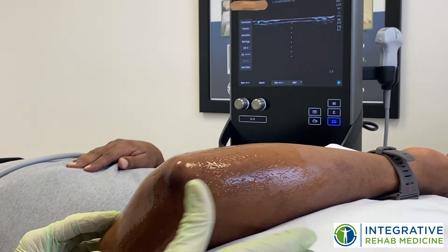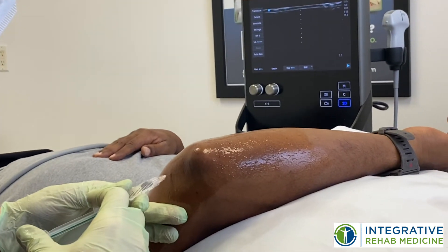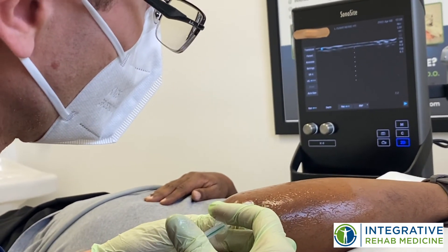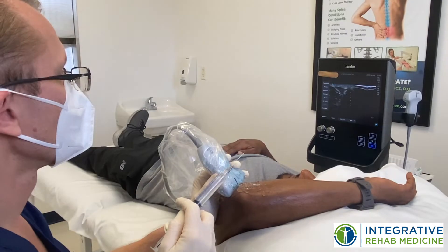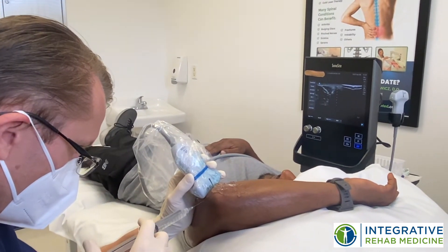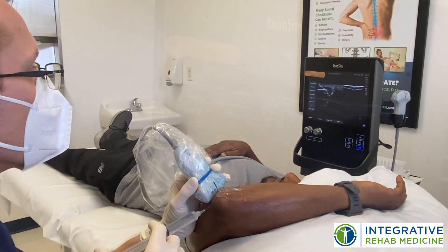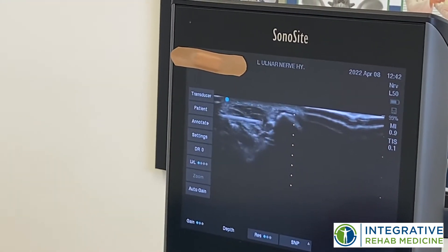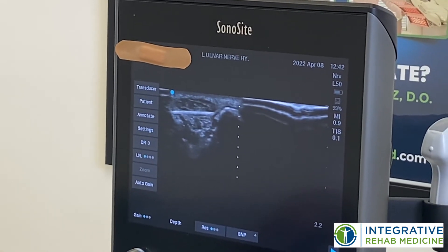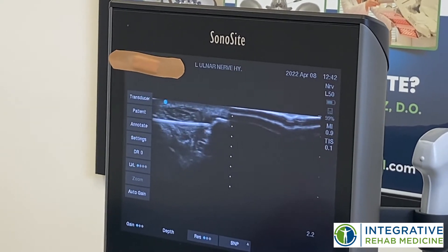I'm going to numb up the entry points. I'm going to start by decompressing the nerve a little bit above. You can see my needle going towards the nerve, and I am right close to the nerve. We're going to inject a little bit of the solution above the nerve, and I can see the space around the nerve opening up.